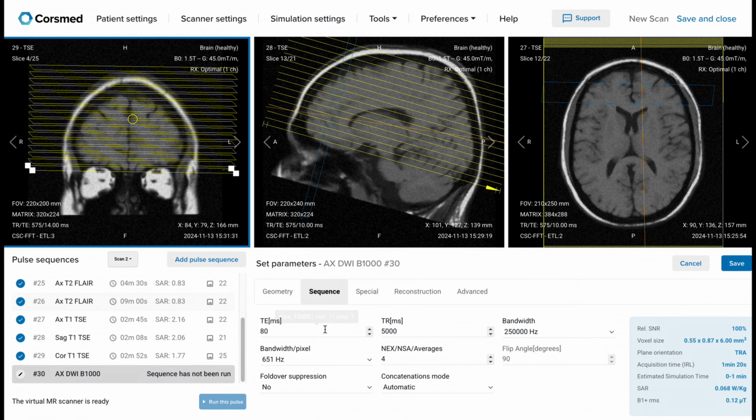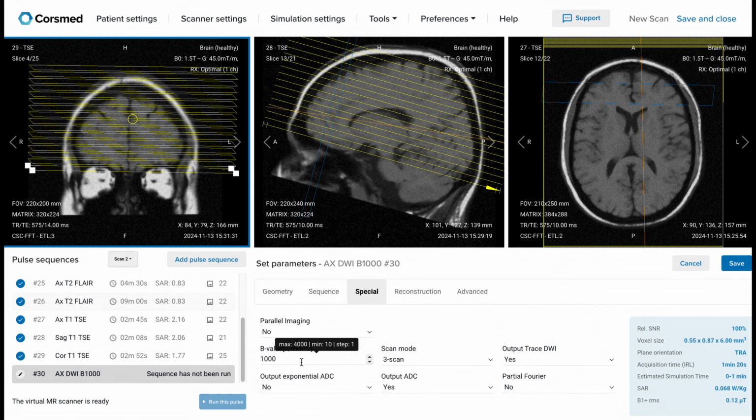The diffusion-weighted image has a special value called the B value, which controls how sensitive the sequence is to the movement of water molecules. In healthy brain tissue, water flows naturally along and between cells. But in damaged areas, like a stroke or a tumor, water gets trapped because cells swell or tissue becomes denser. A high B value in DWI makes the sequence more sensitive for detecting restricted water motion.